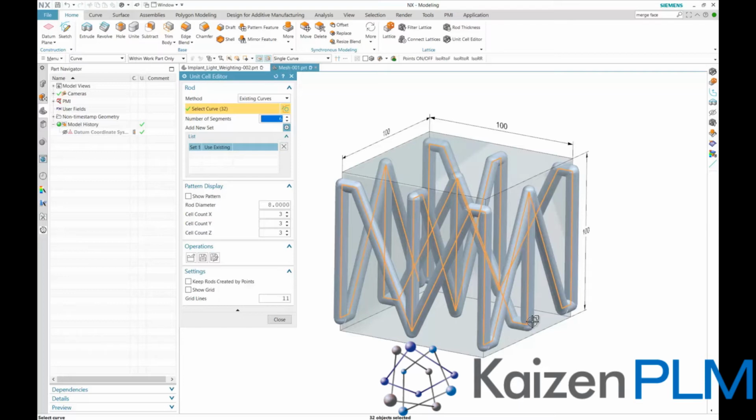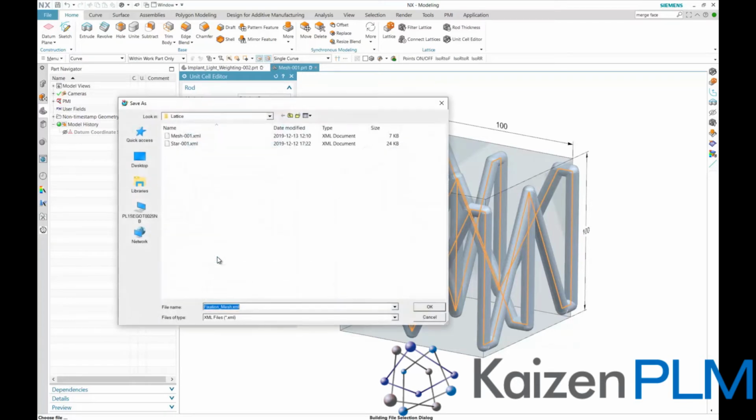A tip here is to keep the number of segments to a minimum. Depending on the complexity of the lattice unit cell or the curves defining it, you might want to use more segments for accuracy. However, you should be aware that it will impact the performance, so please be careful when you set the number of segments here. We save the cell unit to the required location for later reuse defining our custom lattice.